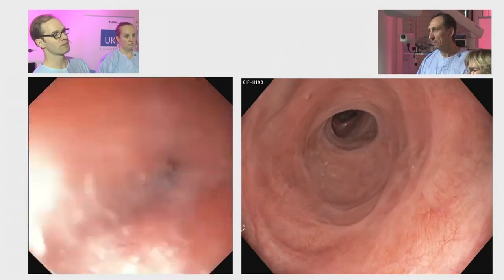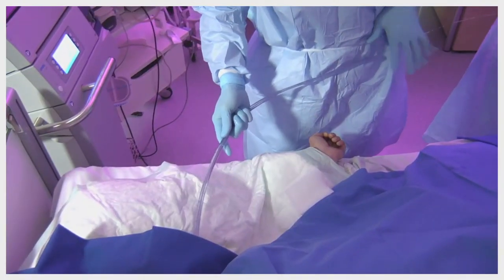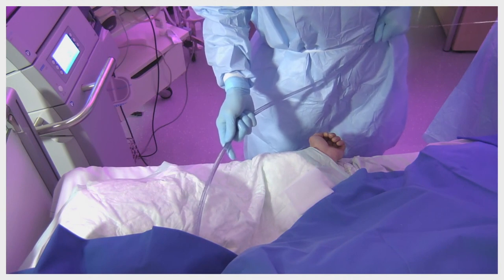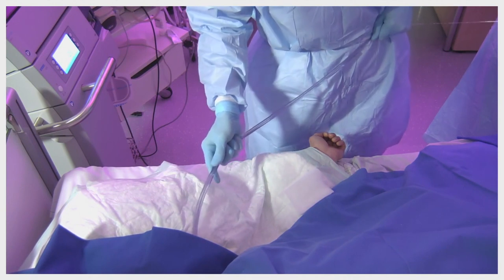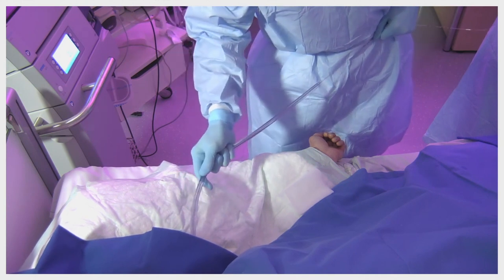What we're planning today is to dilate it using Savary bougies, up to 12 mm. I'm fixing it here at my hip and grasping it very tightly, so that it keeps lying in the Seldinger technique. And I'm slowly advancing the bougie over it.